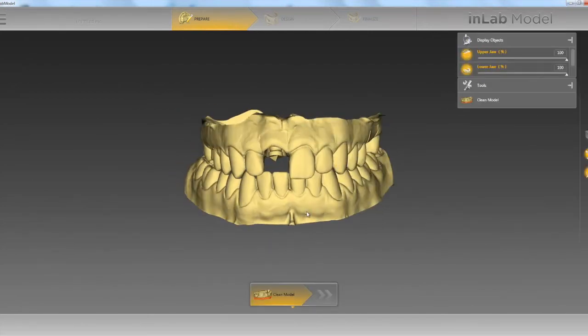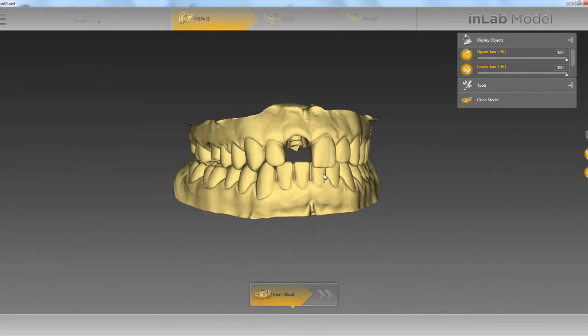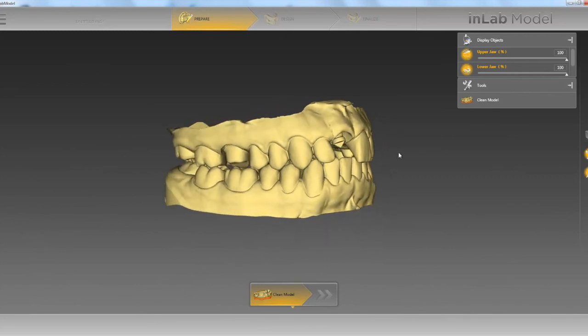Now we have our model in the model builder software. In future videos we're going to go over all the different steps in creating a model.